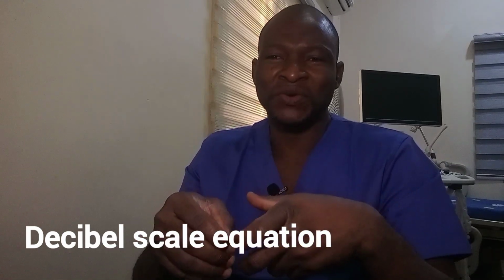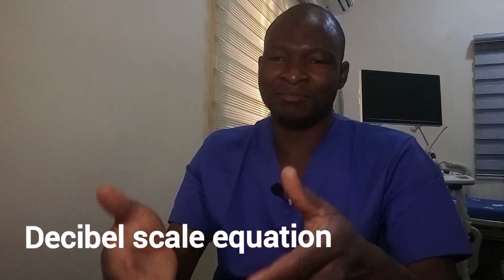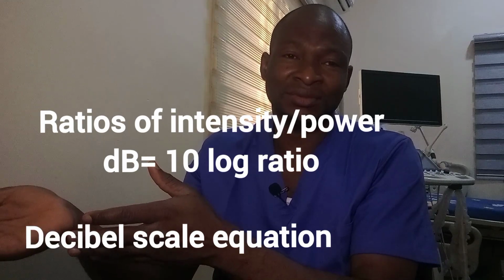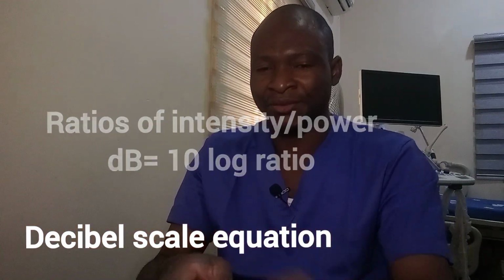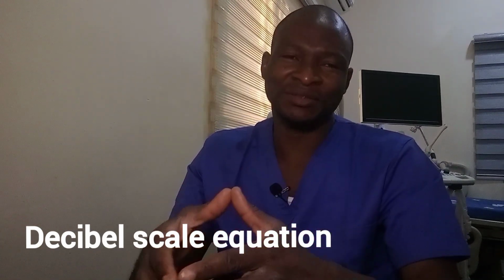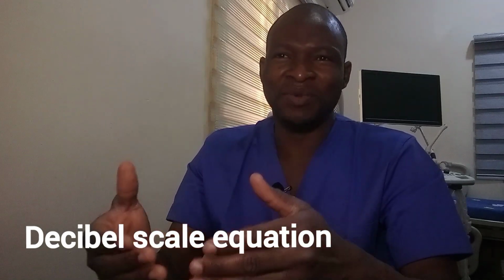The decibel equation for ratios of intensity or power is 10 log ratio. That is, decibel equals 10 log ratio. This is known as the 10 log equation. If the question deals with intensity or power, we'll use this equation.